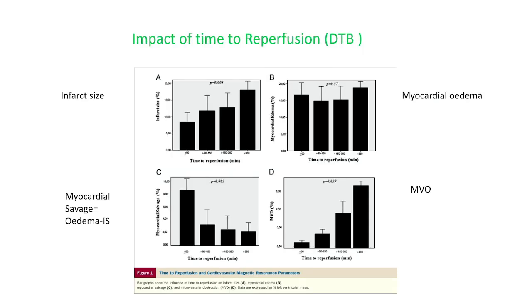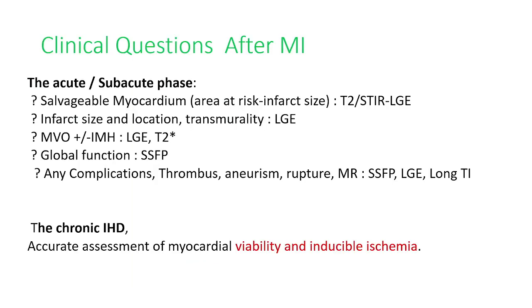So there is a bar diagram showing the edematous myocardium starting from 30 minutes of occlusion, and over 3 to 6 hours it is the same, but infarct starts early in the subendocardium with partial thickness, and over time it becomes full thickness. So myocardial salvage occurs when it is opened early, but over time there's a very minimal amount of salvageable myocardium. And at the end, microvascular occlusion develops in more than 60% of STEMI patients.